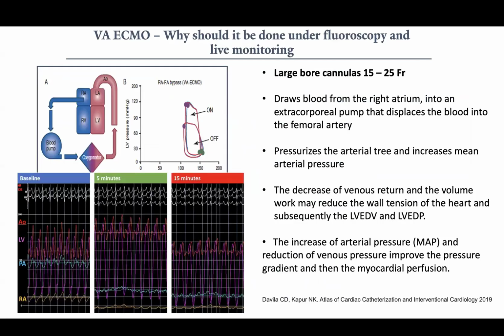Okay, so let me see what this is. This is another hemodynamic tracing of one of those cases. So what's going on here? Yeah, we see a rise in EDP. Can you walk me through that? You're not venting the LV because of the retrograde flow, and that's why we're seeing this rise in EDP. So does everybody understand that?